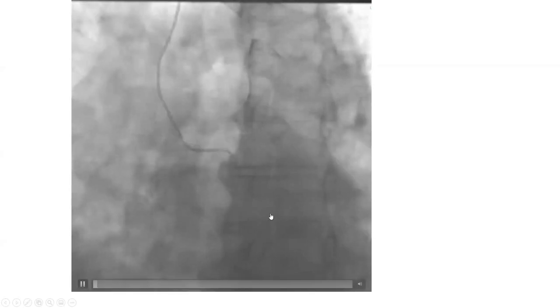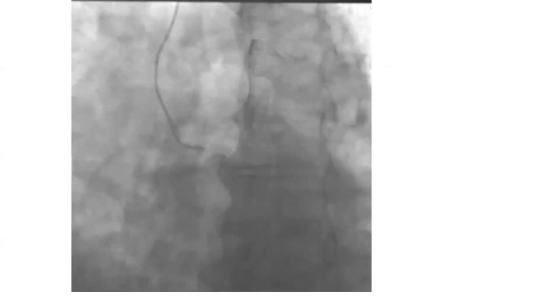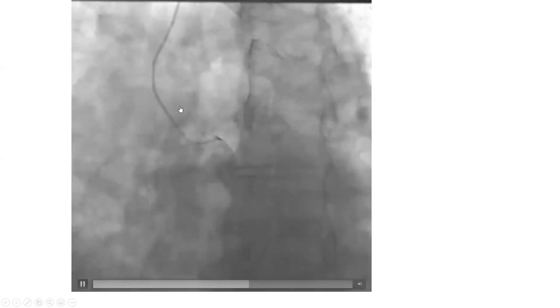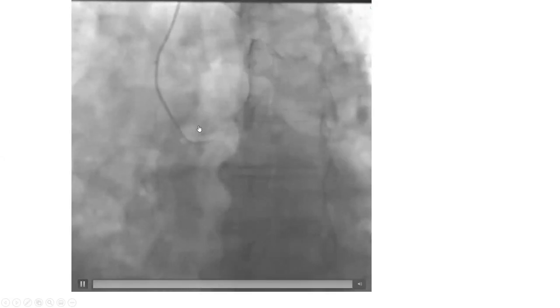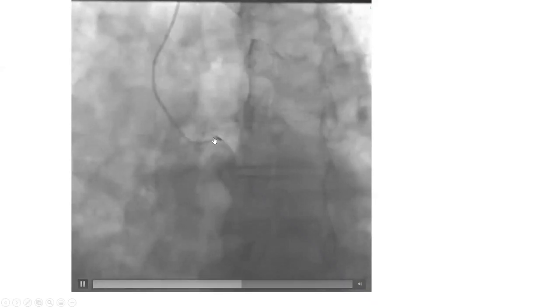Another case — just by looking at the image, tell me the next step. This is a Tiger catheter with an arm of four, in the left cusp, and you see the left coronary in the non-selective puff just above. The catheter tip is pointing down and elongated. The next step is JL3.5 or shorter. You can first try to loop from below with the current catheter, but it's unlikely to succeed. Get a JL3.5.